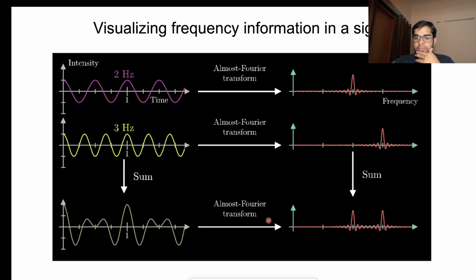Hi. So, while describing this frequency domain thing, many a times Deepak used Fourier and frequency interchangeably. So, does this mean that the Fourier transformation can only be carried out in the frequency domain? Because, as Athar wrote in the chat, we conduct the Fourier transformation just to split a signal as a summation of the many sinusoidals. Correct. So is there any relation between the Fourier and the frequency thing?